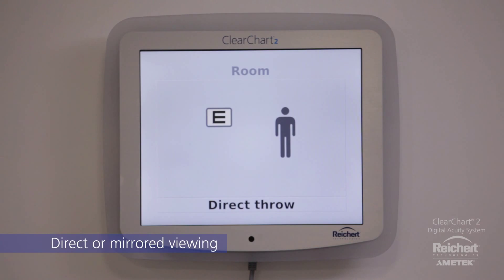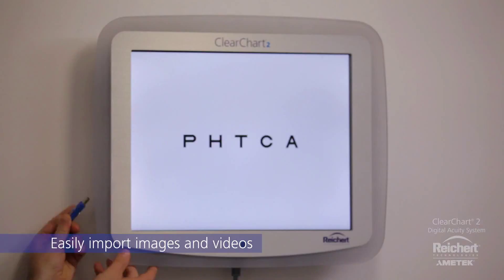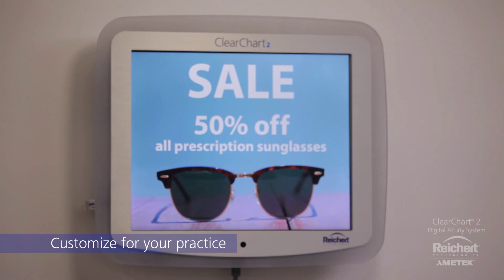ClearChart 2 can be configured for mirrored viewing to accommodate any refracting distance. ClearChart 2 users can even add images and videos to customize the system — simply import the files from a USB drive.